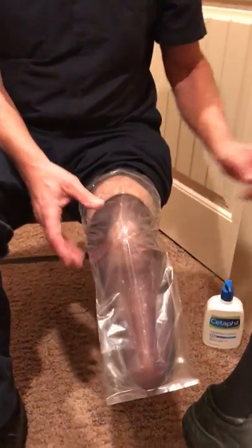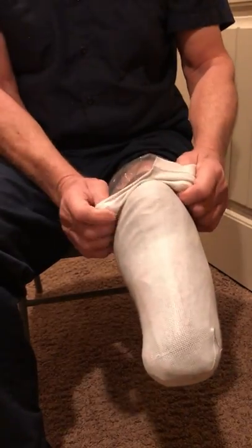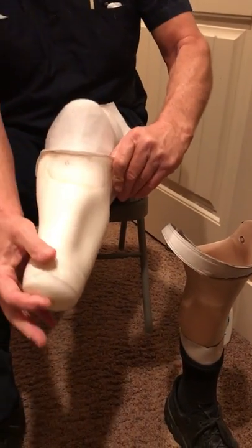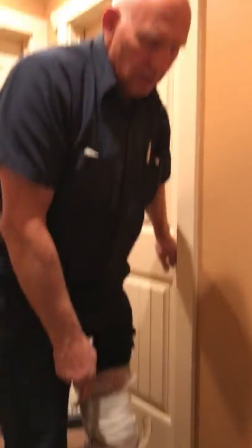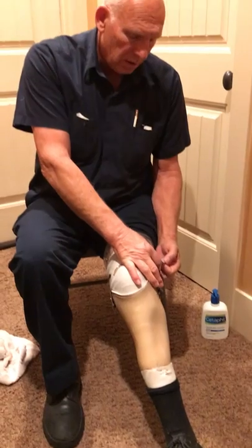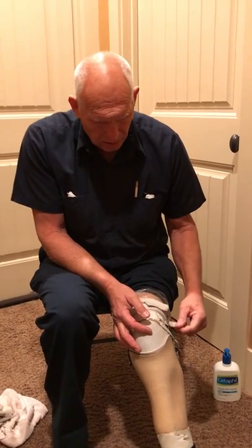So I put on the second bag, then I take my stump sock — seam out again, inside out. I put that on. Then I take my liner out and put it on my stump. I found out that if you stand up and step into your leg, it works a lot better than if you pull your leg on. I have a strap on my leg. I like a strap because I know my leg is not going to come off.